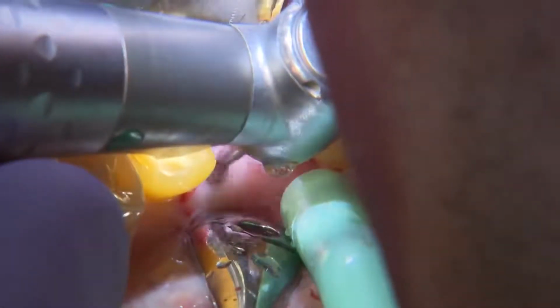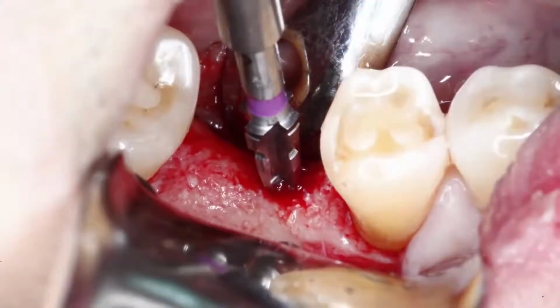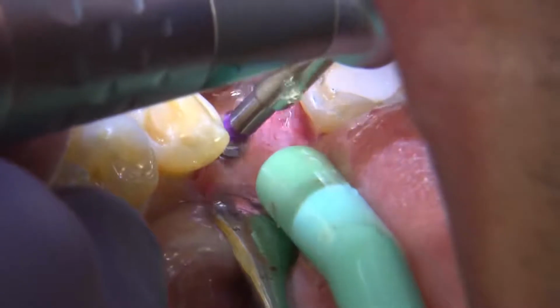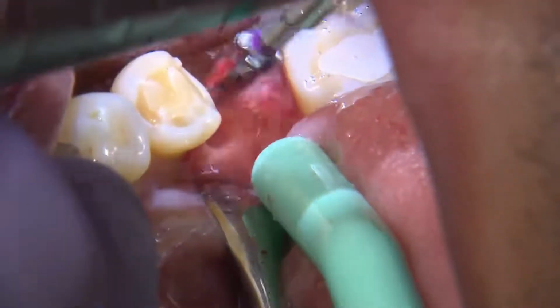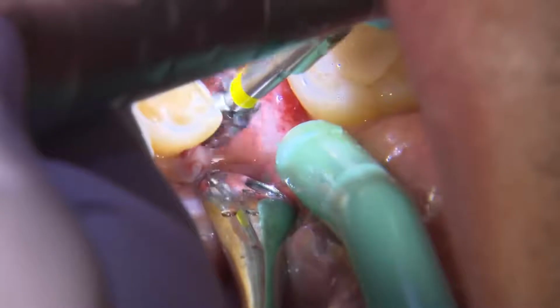So in this case, I move to the next osteotomy drill, and then I follow that up with the shaping drill, which you see here. It's important to use irrigation when you're using the shaping drills so that you don't cause any necrosis of the bone. The RPM I use is between 800 to 1200 RPM, and I'll go slowly and create my osteotomy in order for the area to receive the implant.